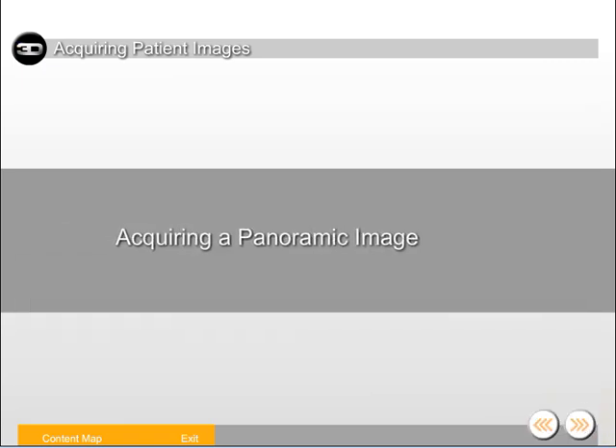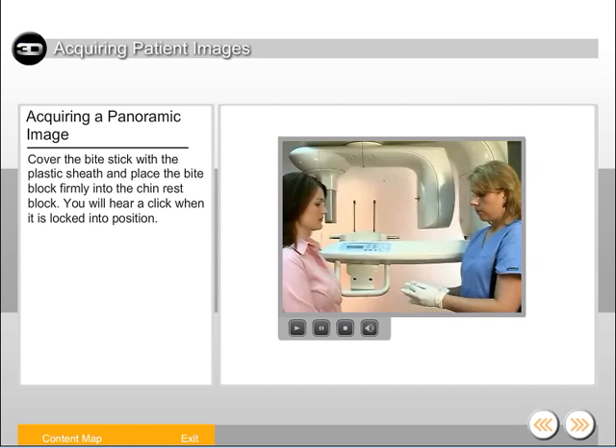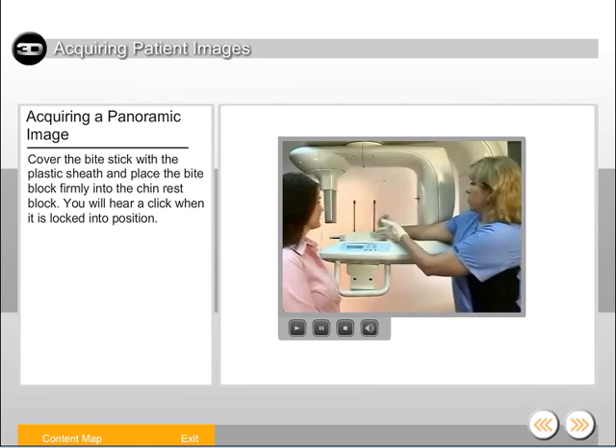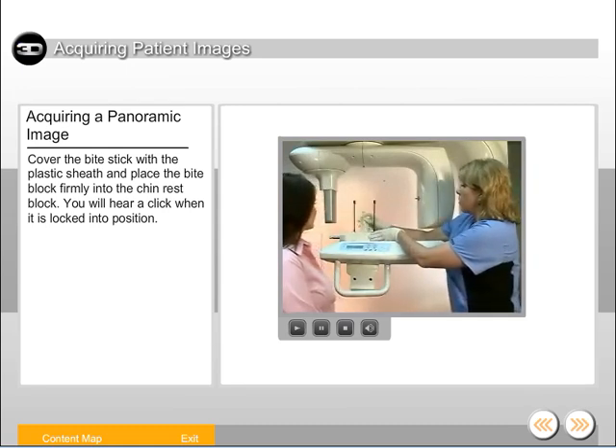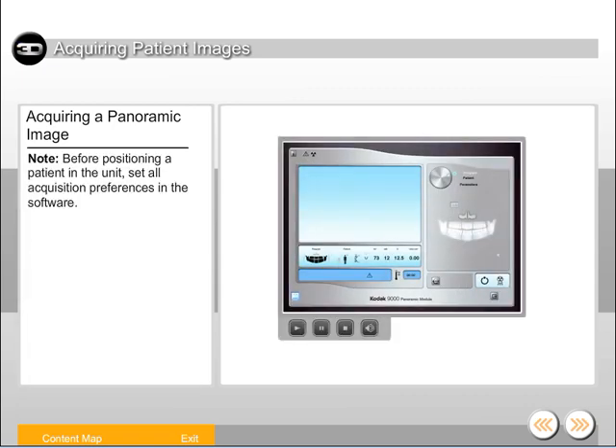Let's take a look at positioning a patient to acquire a panoramic image. Cover the bite stick with a plastic sheath and place the bite block firmly into the chin rest block — you will hear a click when it's locked into position. Use the 3D head adjustment button to adjust the chin rest to the full upright position. Use the height adjustment button to adjust the machine slightly higher than the height of the patient. Before positioning a patient in the unit, set all acquisition preferences in the software.